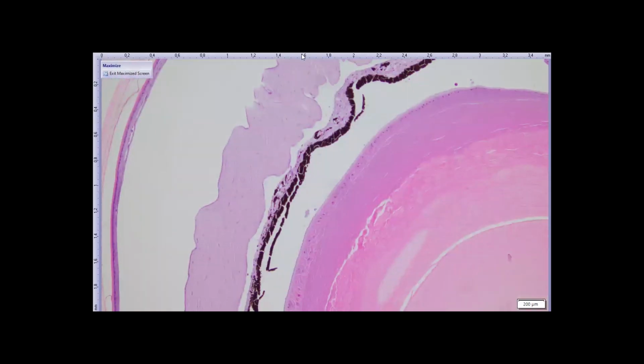A little bit more of a recognizable epithelium on the cornea here. And the stroma is much thinner. I don't know what the significance of any of this is, but the stroma is much thinner than in that python. And then the outer generation is ready to slough. And now you can see there's an inner generation at least partially intact, allowing for ecdysis to occur. That's the main reason I wanted to show this.